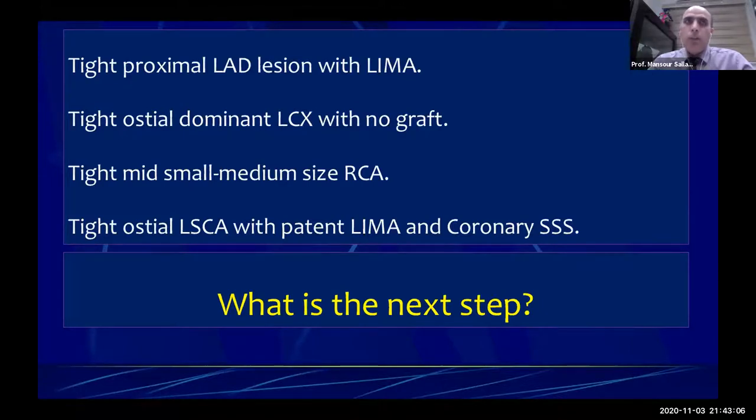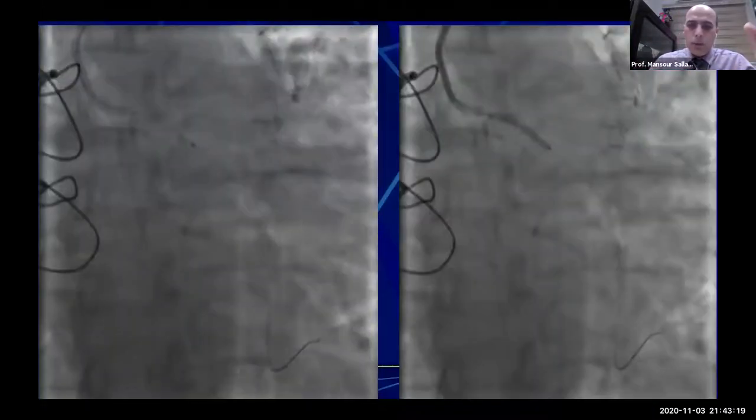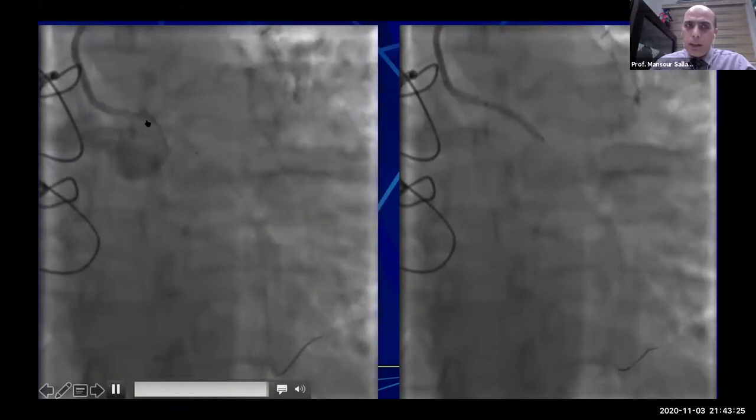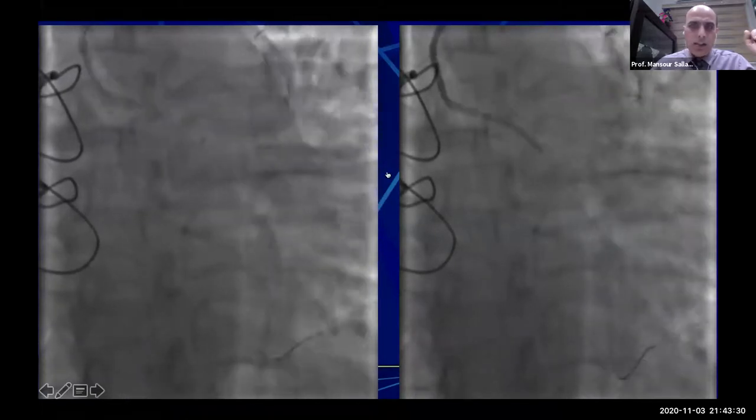Left subclavian artery stenosis, despite there is stenosis, the LAD itself flows, there is TIMI 3 flow, even antegrade flow, TIMI 3 flow. So I think my approach was to go to LCX, and also I went from the same left radial approach. So I went to the LCX, ultra short left main. I think predilatation is mandatory for those lesions. Direct stenting, I think, is discouraged completely.